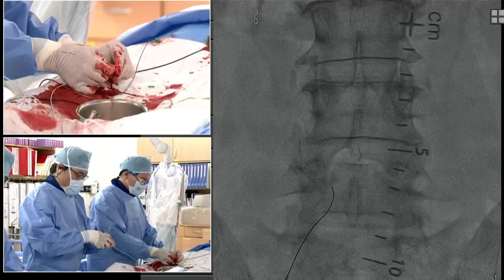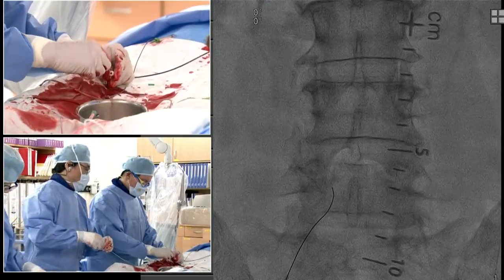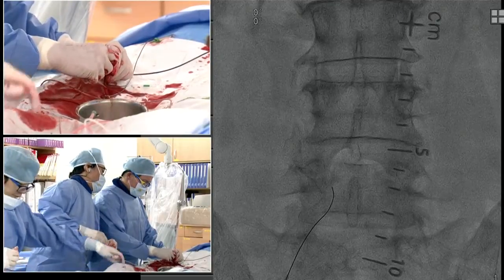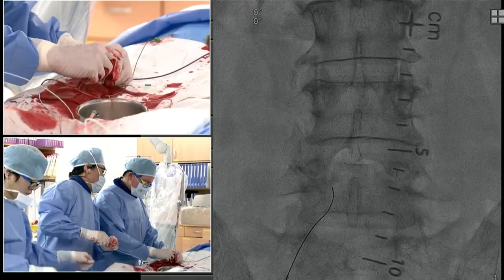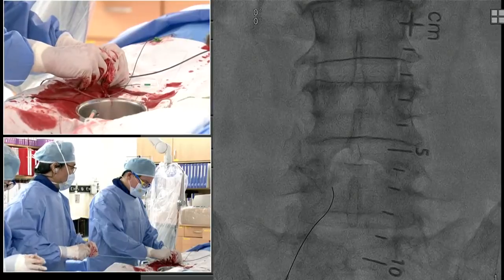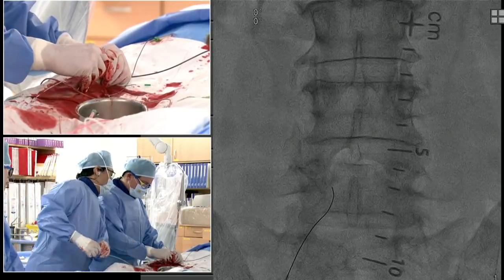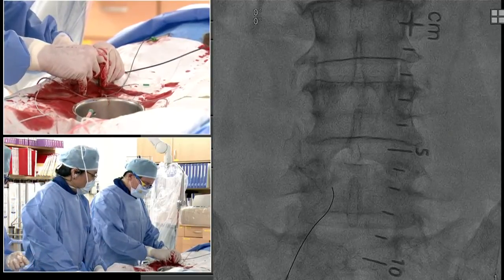Wire going okay, easy? Solve this problem. No, not yet. Not yet, okay. Wire going? Yeah. Wire's going through? Okay. I think, is it going? No. It's not fitting? Oh, there it is, okay.